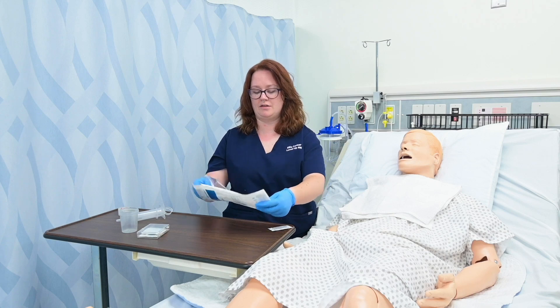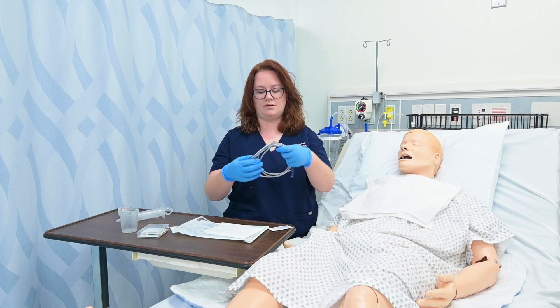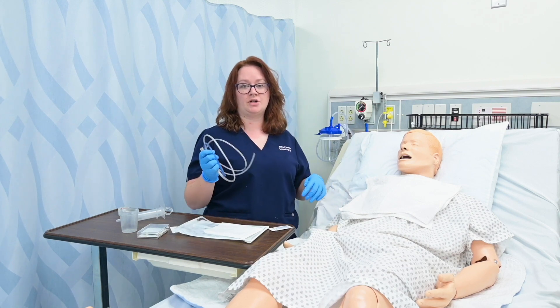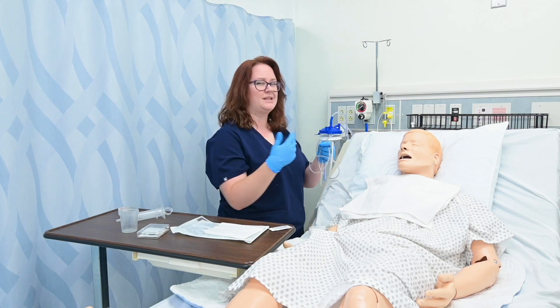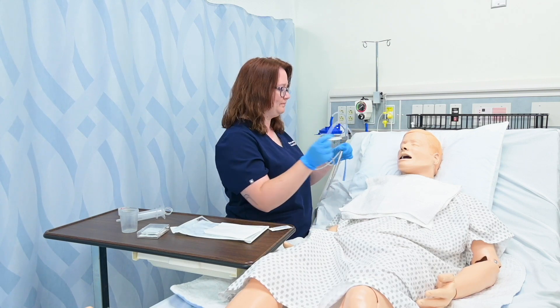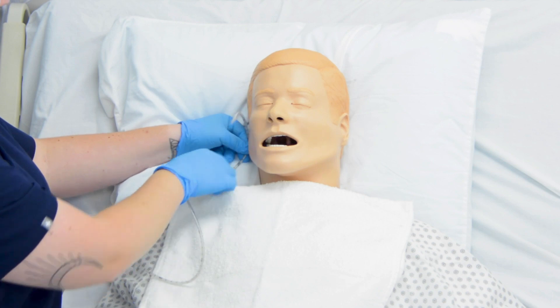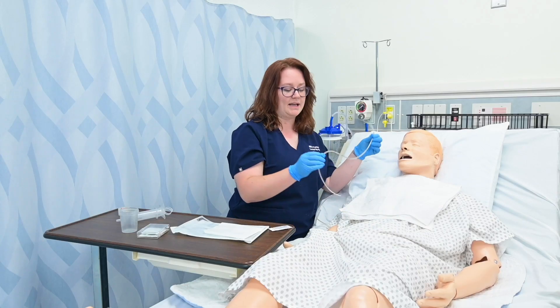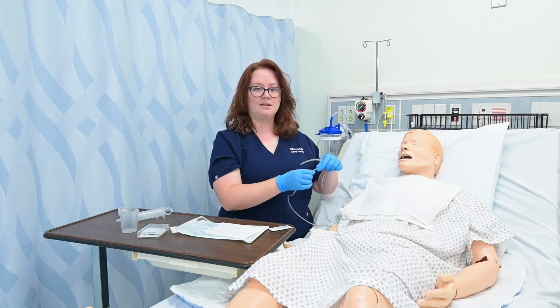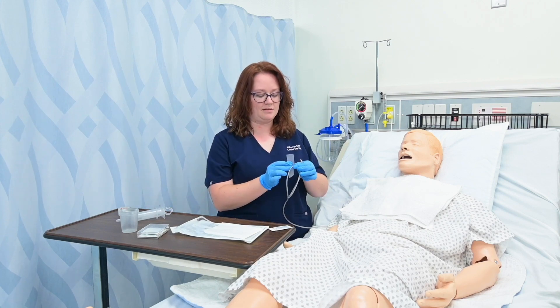I'm going to open their NG tube and my first step is to measure it. I need to measure where on this tube I should stop the insertion. So I'm going to start at the tip of their nose, go to their earlobe, and from their earlobe go to their xiphoid process — that tip of their sternum. I can estimate that at about 50 is where the end of this tube should be. I'm going to mark that with some tape, but you could use a marker if you wanted to.